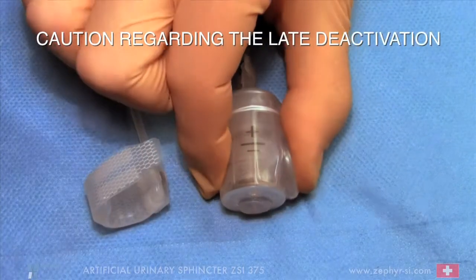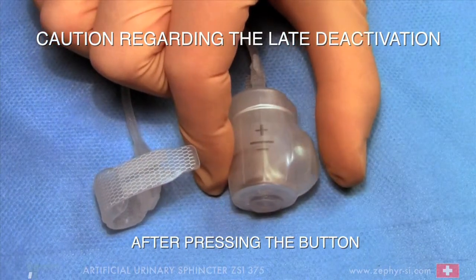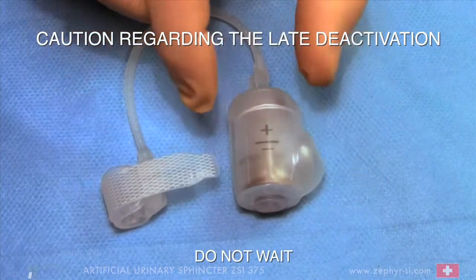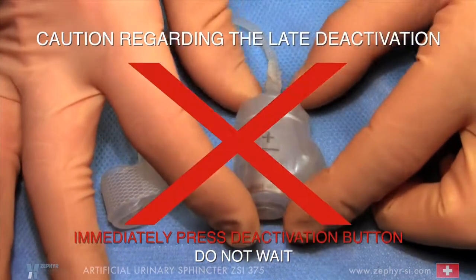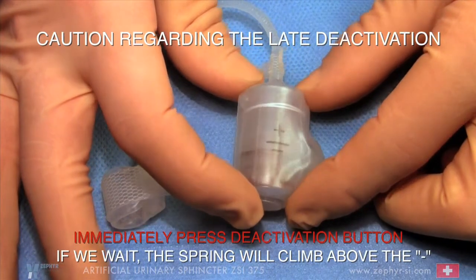Caution regarding the late deactivation. After pressing the button, do not wait. Immediately press the deactivation button. If we wait, the spring will climb above the minus.